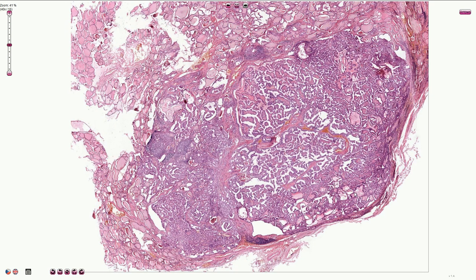Here we have the tumor and in this part of the slide we can appreciate normal thyroid parenchyma. When we are lucky, the papillary carcinoma is truly papillary, as in this part of the picture where we see the papillary features — this is also described as the classic variant of papillary thyroid carcinoma.